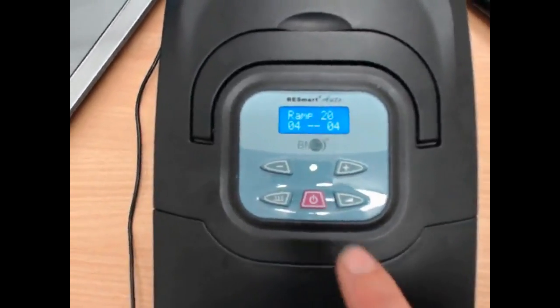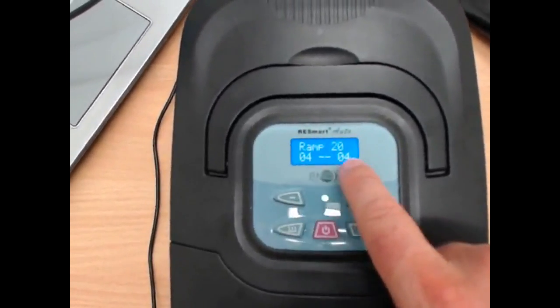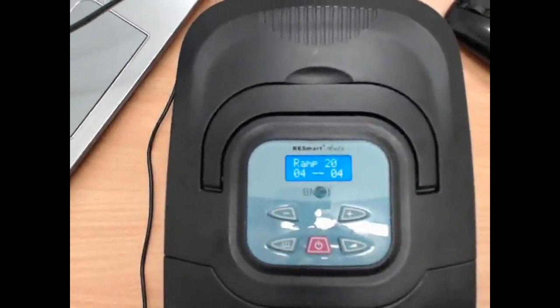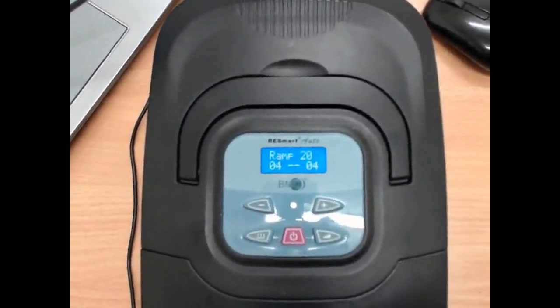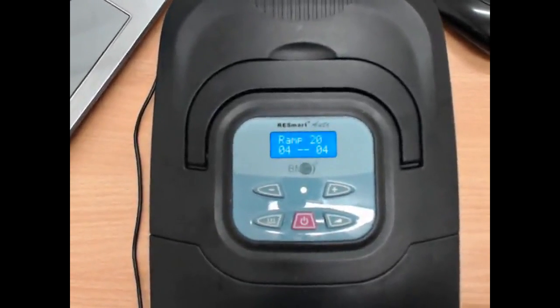Alright, so on the screen here it says 4-4, so that's the initial pressure and the treatment pressure. We've put them both the same, which means the machine will start at 4 and it will basically go between 4 and our maximum pressure, which is 14. Alright, so that's how you change it.